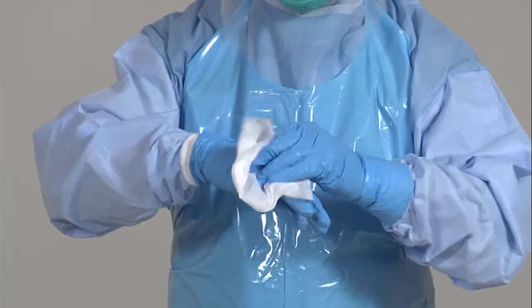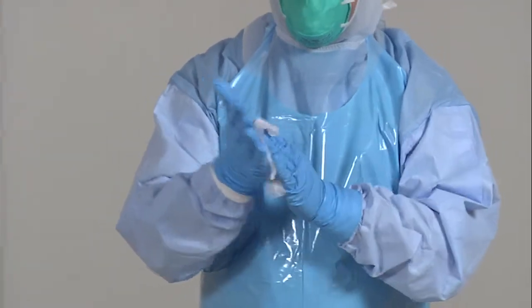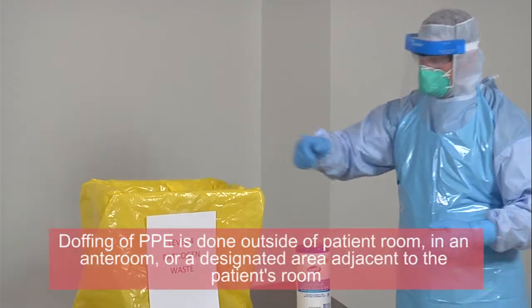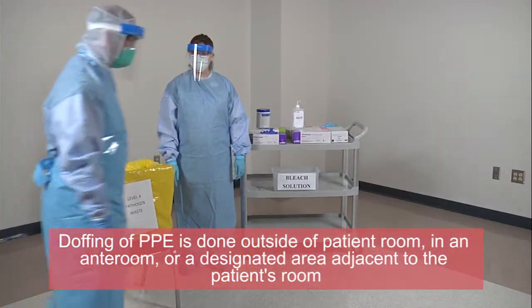Exit the patient's room into the ante room. A quality monitor will assist you in the doffing of Level 4 PPE.